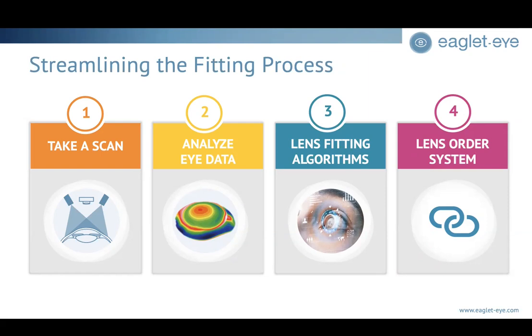When we design lenses empirically using profilometry like the ESP, using the technology does not take the place in most cases of putting a diagnostic lens on the eye to determine power, especially on irregular eyes. And so we'll use first analysis of the data to pull a starting lens and use that data to easily and quickly get lenses on the eye in the clinic without a whole lot of effort on my half.